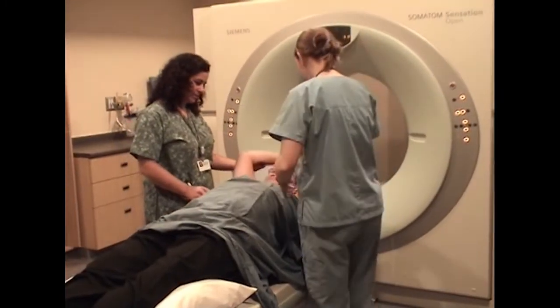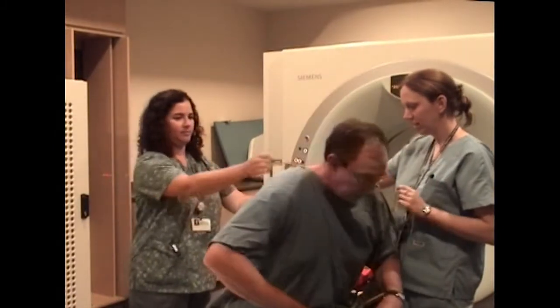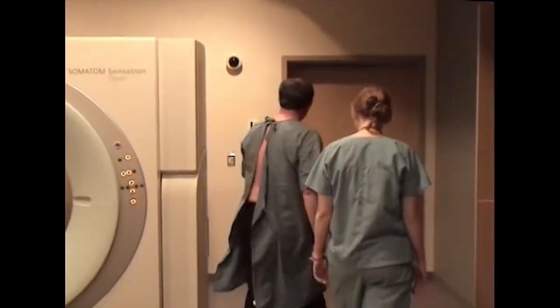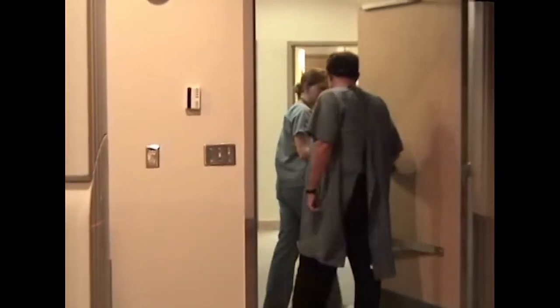You may not see your radiation oncologist at this simulation appointment. However, if needed, your oncologist will be sure to speak with you before you leave. You may now change back into your clothes. Please check in at the reception desk before you leave the center to pick up your appointment letter. This letter has the date and time of your first radiation treatment appointment.